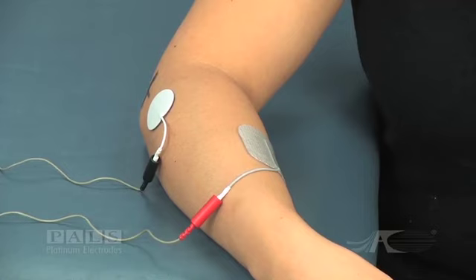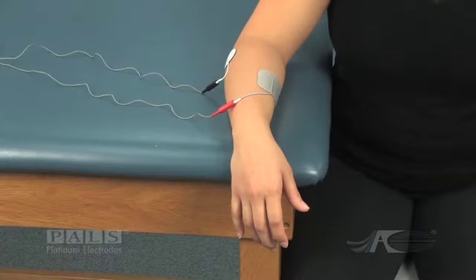The negative electrode is still placed very proximal on the forearm near the lateral epicondyle. The positive electrode has now been placed on the flexor surface of the forearm, allowing the current pathway to pass through the supinator muscles.